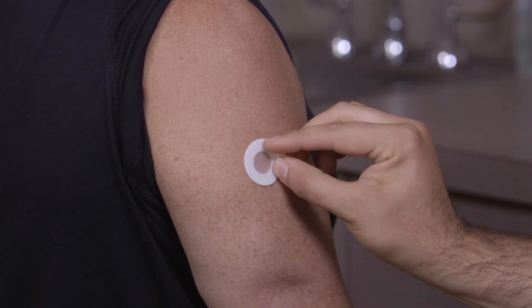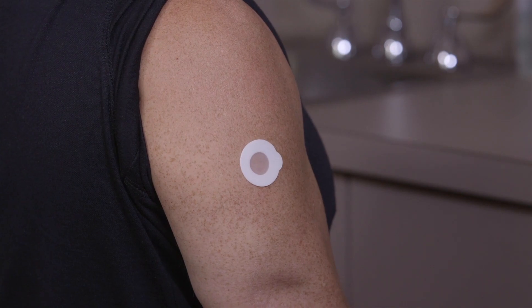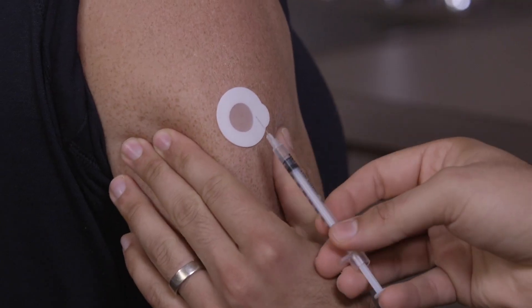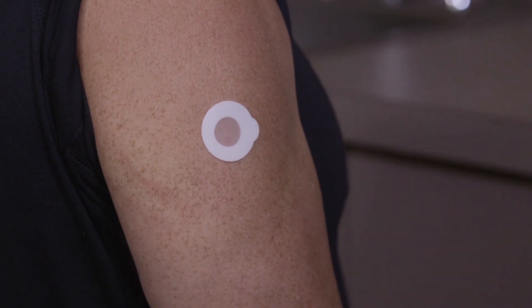Apply the InjectSafe Barrier Bandage to the skin without touching the membrane area of the bandage. Use the alcohol wipe again to swab the InjectSafe Barrier Bandage. Then pinch the skin and inject the needle in the center of the InjectSafe Barrier Bandage.